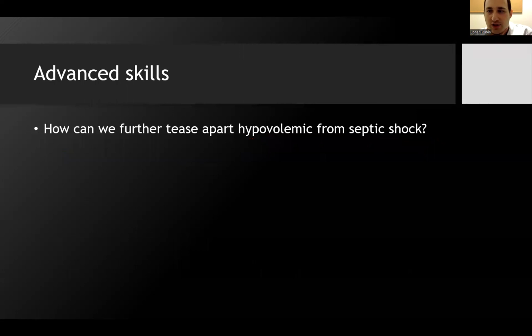Now, we mentioned how this could be hypovolemic or septic or both. Or hyperdynamic, I should say, maybe a high output cardiac state. How can you further tease apart hypovolemic from septic shock? Anyone? Warm versus cold extremities. Okay, exactly. That's a fair point, a physical exam skill. I was going for echo things too, but yes, that's another very fair point.